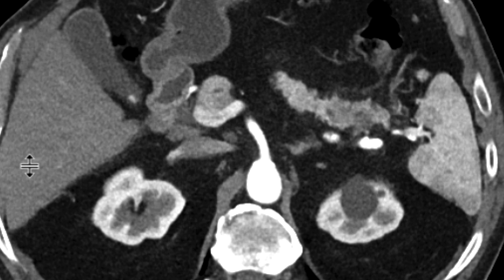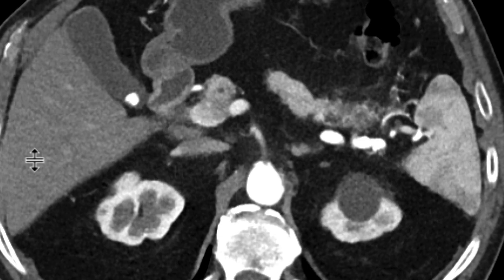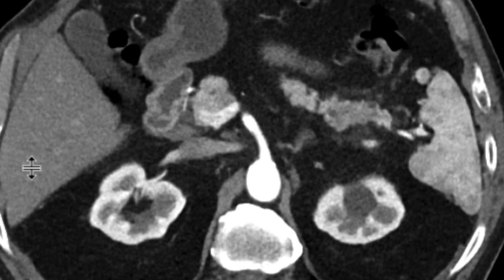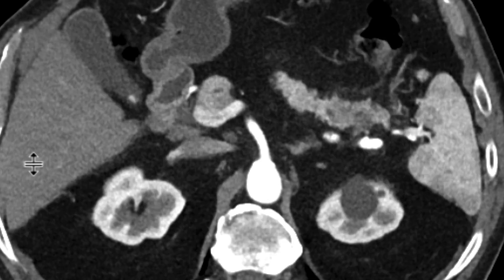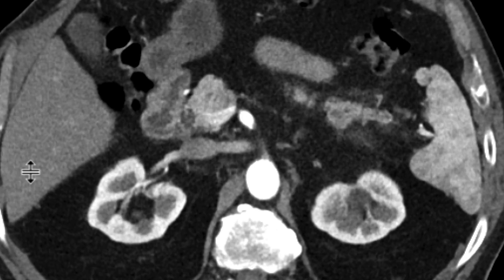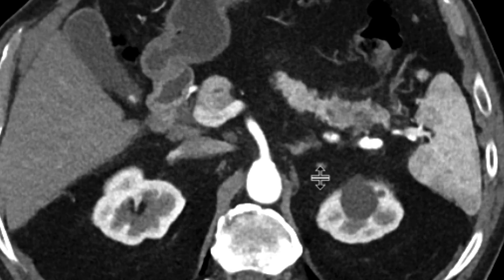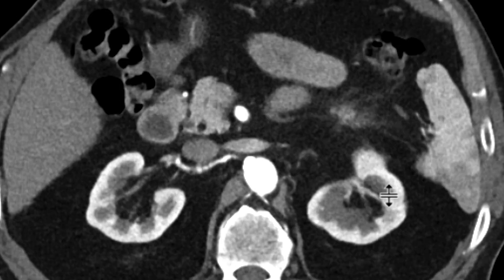You can clearly see some of that inflammatory change has improved. But right around that area of mass-like enlargement of the pancreas we saw in the non-contrast study, there is an ill-defined hypodense mass over there. And upstream from that, the pancreatic duct is slightly dilated.